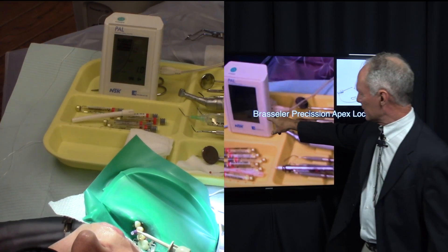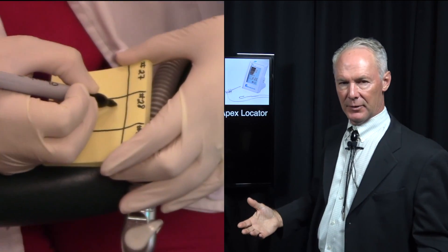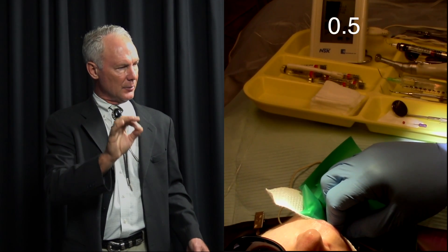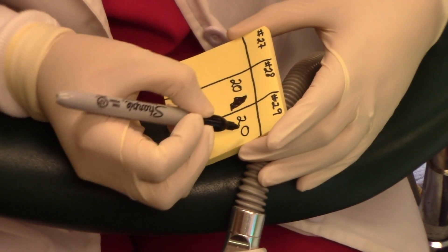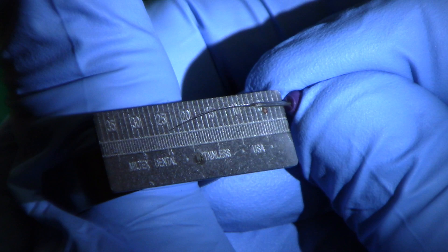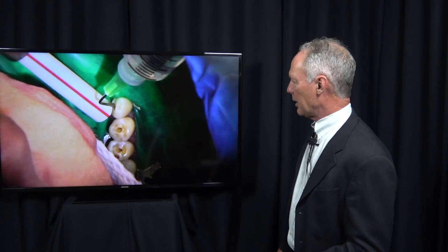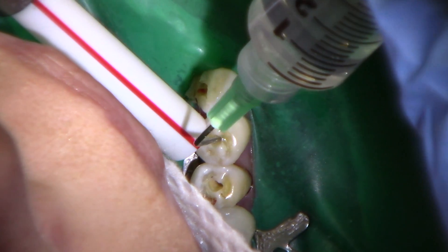Now if the apex locator reads 1.5 millimeters, you can take that reading and know that with your rotary files or hand files you need to go a millimeter more. Doing that with those three teeth, we're marking the length on a piece of paper because you'll forget the length if you're doing more than one tooth or more than one canal. The cuspid was 22, the first bicuspid was 20, and the second bicuspid was 20. That's my working length. I'm going to irrigate again with the sodium hypochlorite and water.